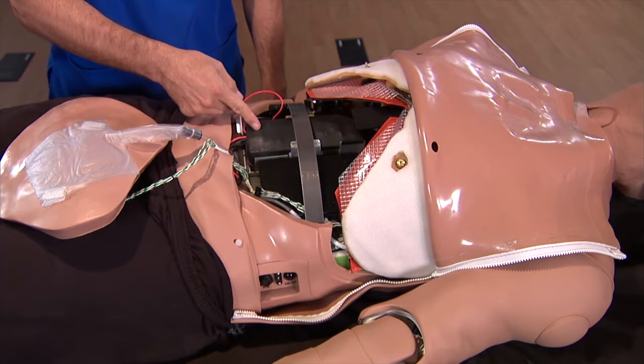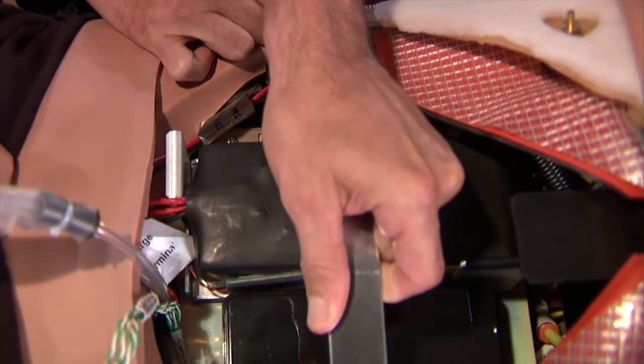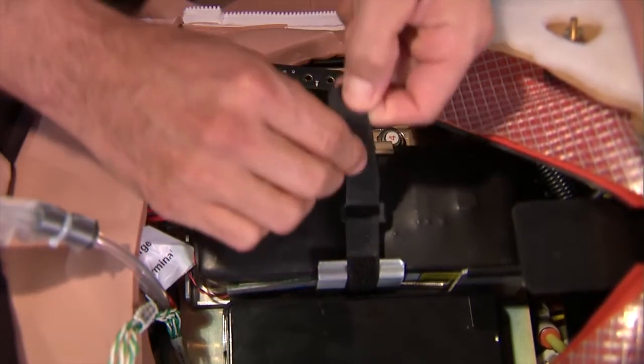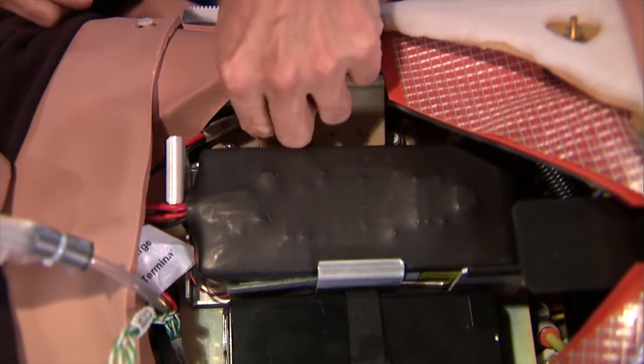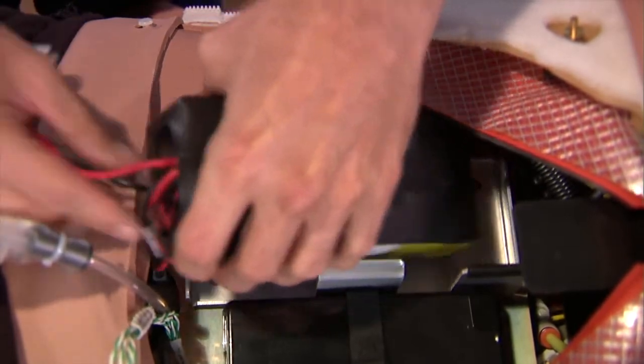Here's the battery. Remove the abdominal support by pulling it straight up out of the slots. Release the Velcro strap that holds the battery in place. The battery leads are plugged into the simulator on the right side of the battery. Unplug the battery leads, and then lift the battery out of the housing.